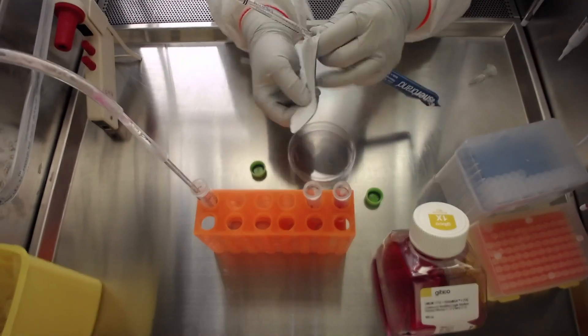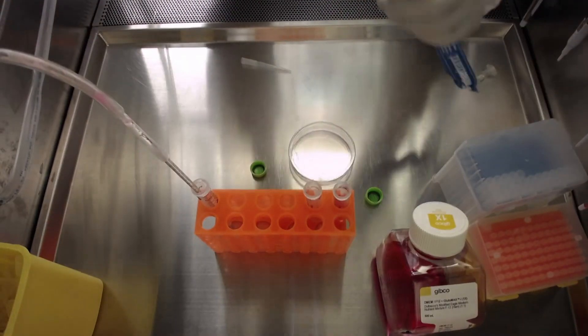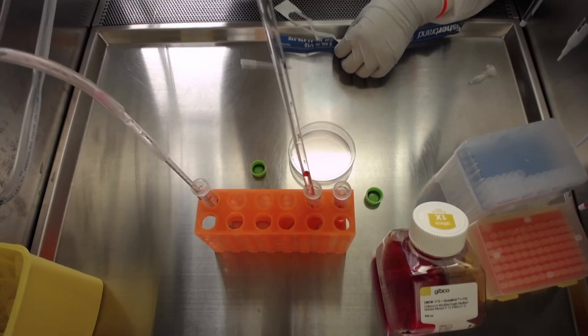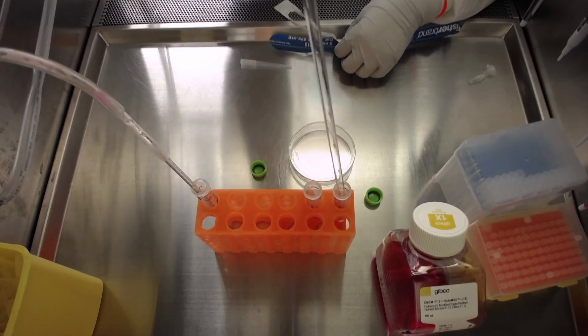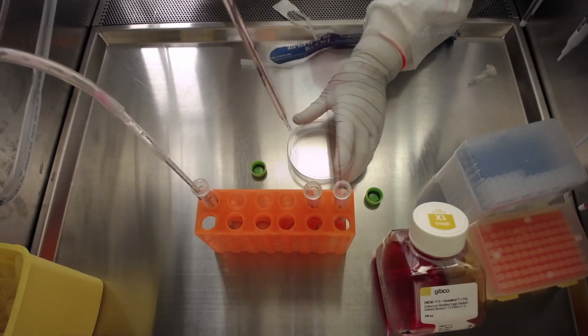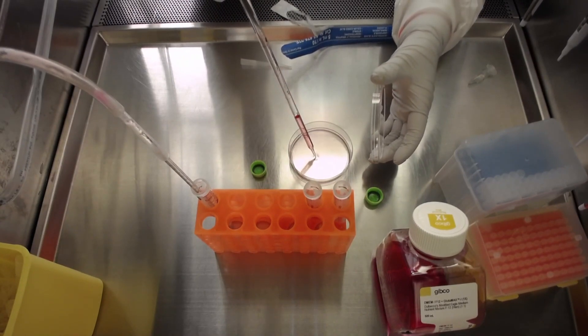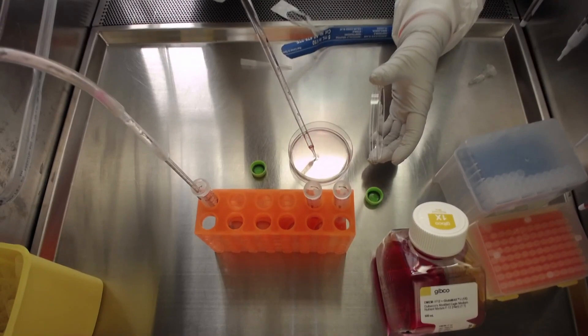With a serological pipette, take 2 milliliters of media with rock inhibitor and slowly add it to the tube containing the cells. Take the remaining 6 milliliters of the media with rock inhibitor and add it directly to the dish. This is important to avoid the dish from drying up.